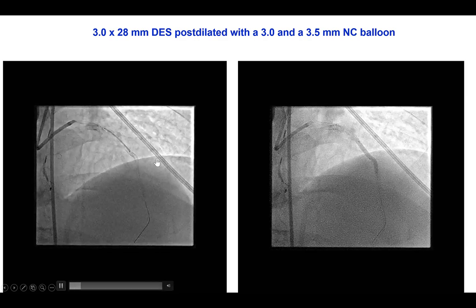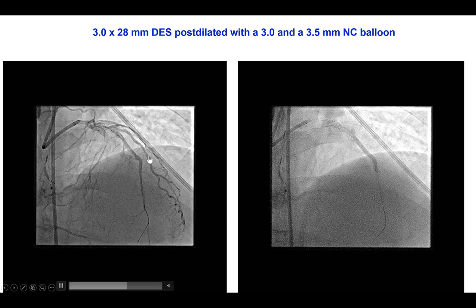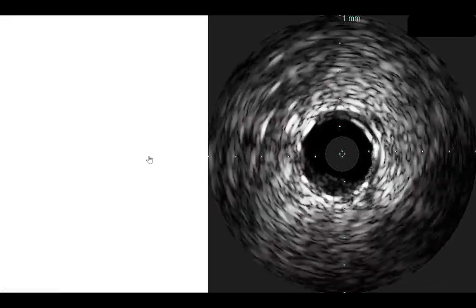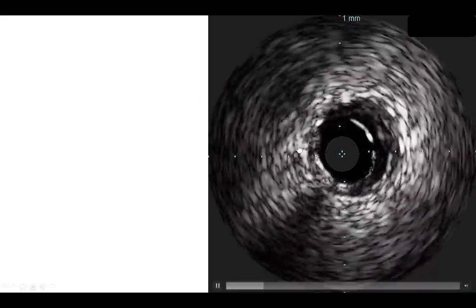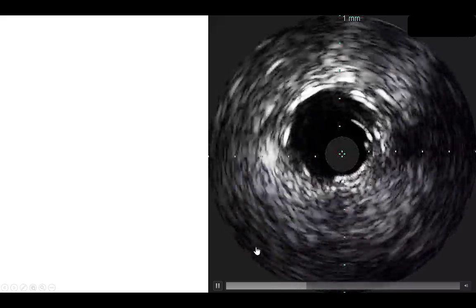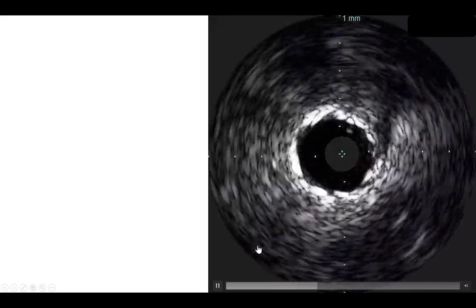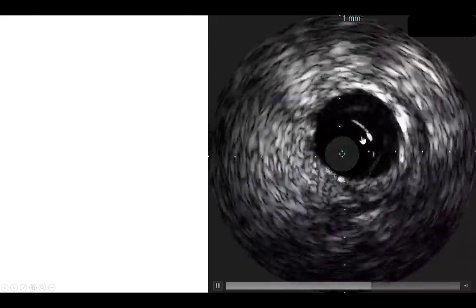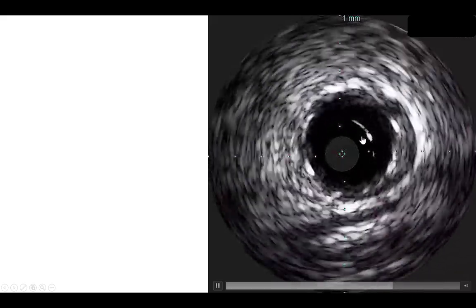One additional stent was placed more proximally, followed by high pressure balloon inflation throughout the LAD stents. This was successful in expanding the stents, as confirmed with intravascular ultrasound. High pressure balloon inflations were successful in expanding the stents in our case. Had they not been successful, laser with contrast would likely have been the next step.